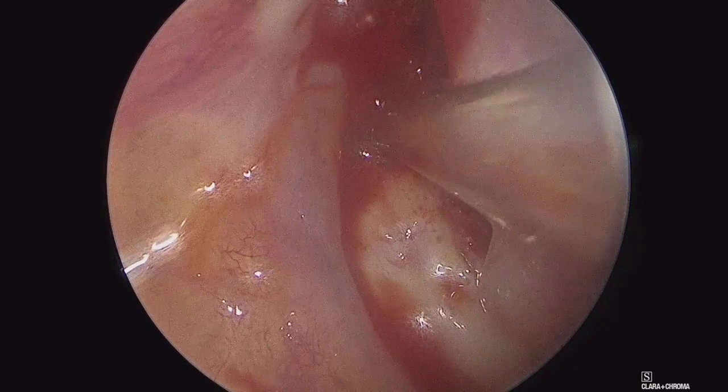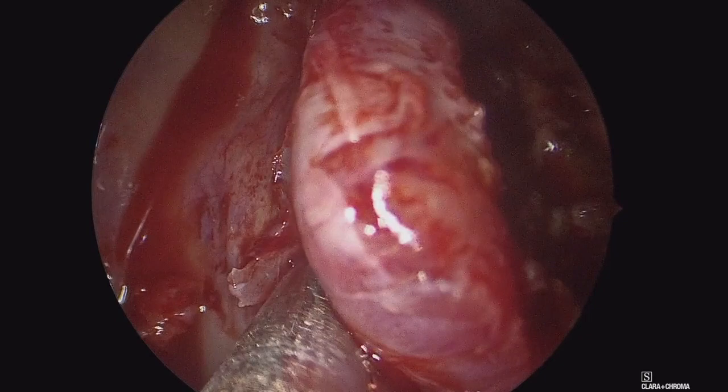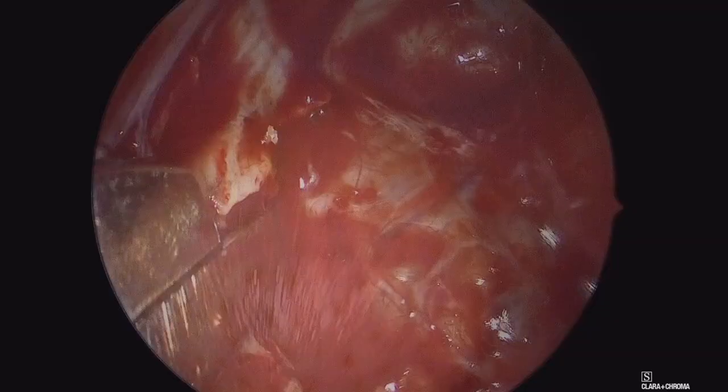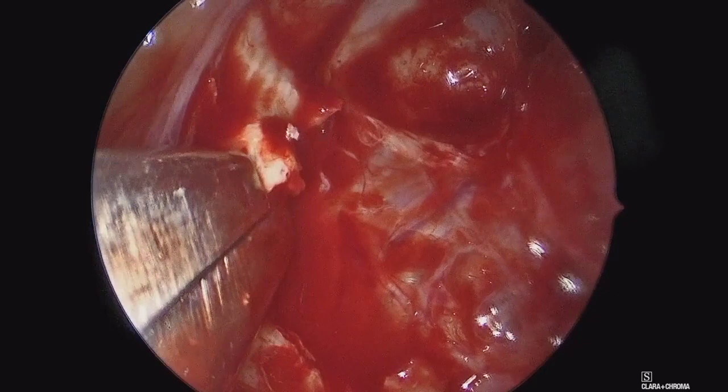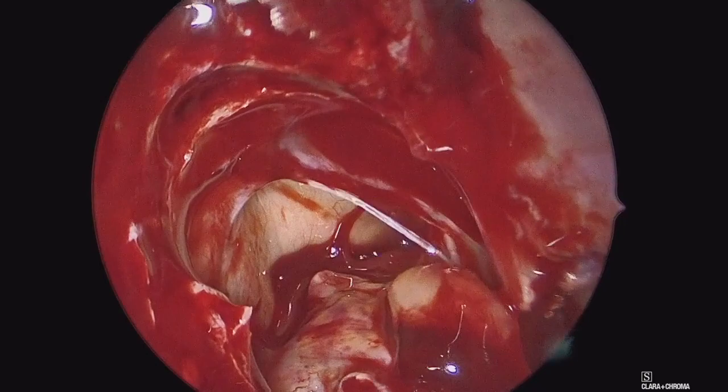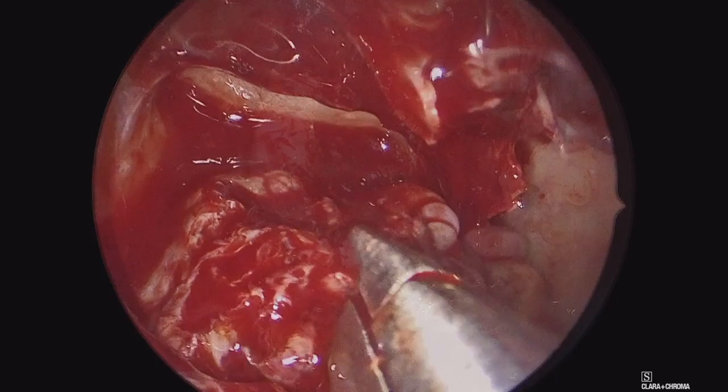Here we are taking down the posterior wall of the maxillary sinus through that Caldwell-Luc approach, getting out towards the infratemporal fossa. We did our best to leave the periosteum of the pterygopalatine fossa intact, which facilitates a lack of bleeding as well as keeping the fat in place so it's not spilling out into the field. This also allows us to work through a combined approach both endoscopically through the nose as well as through the Caldwell-Luc to get that lateral exposure.